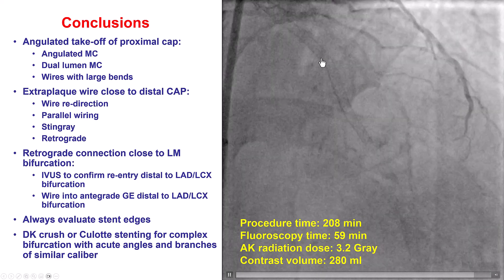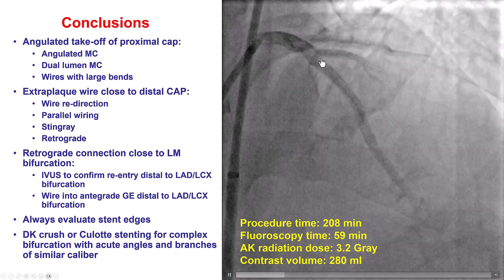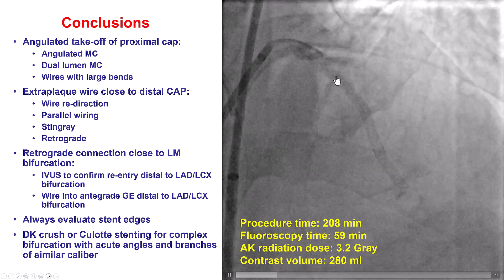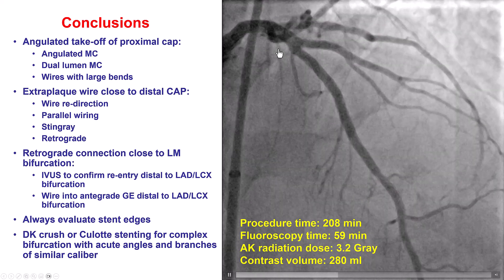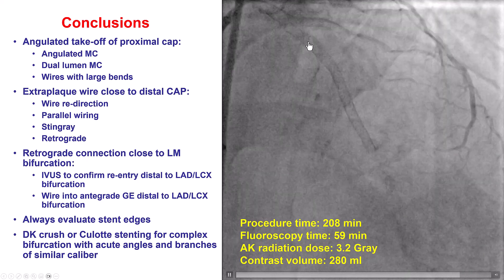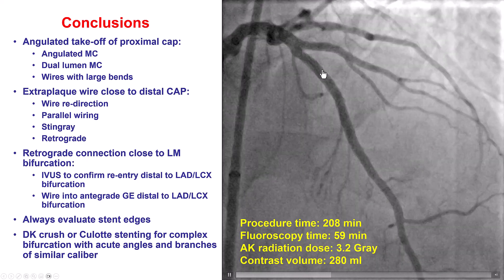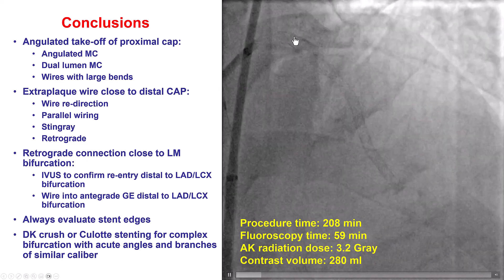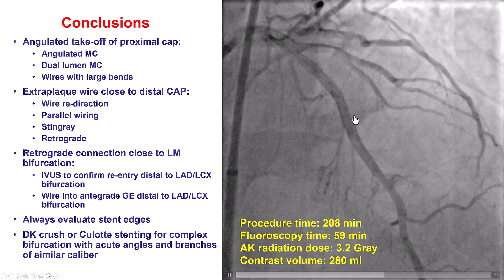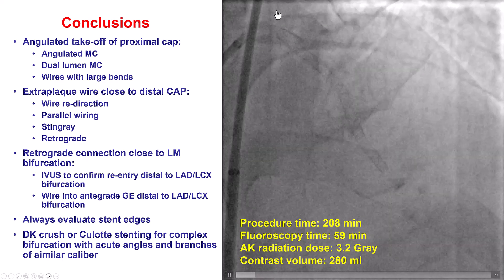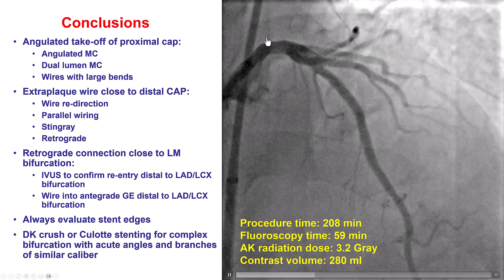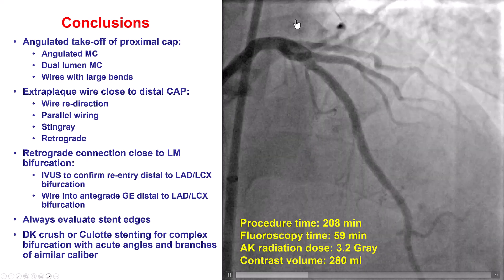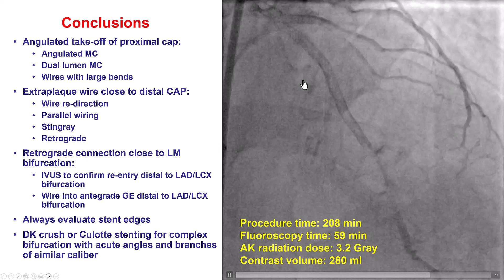When we did the retrograde crossing, it was actually easy crossing from the distal true lumen to the proximal true lumen. But before placing stents, we need to confirm that there is no re-entry close to the left main — because if the retrograde wire had re-entered into the true lumen close to the left main bifurcation, that could result in loss of multiple branches, including the circumflex.